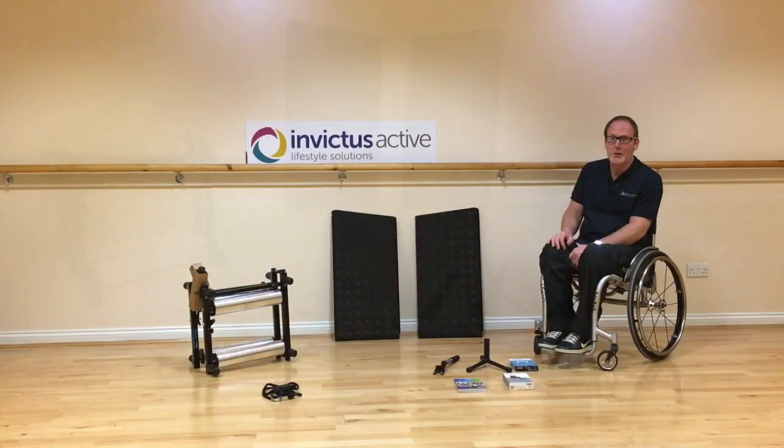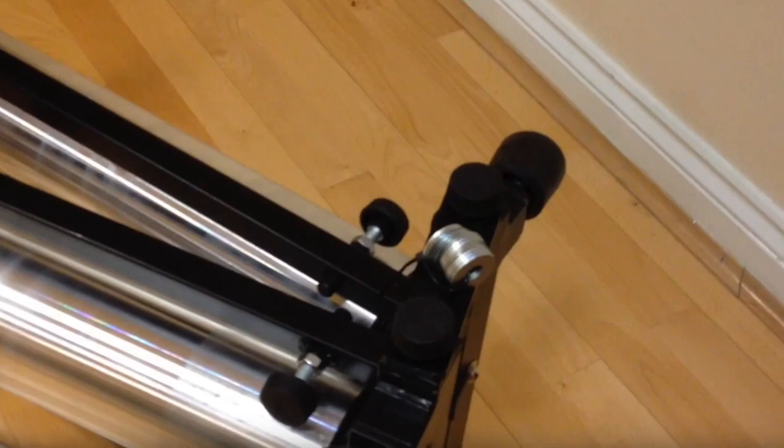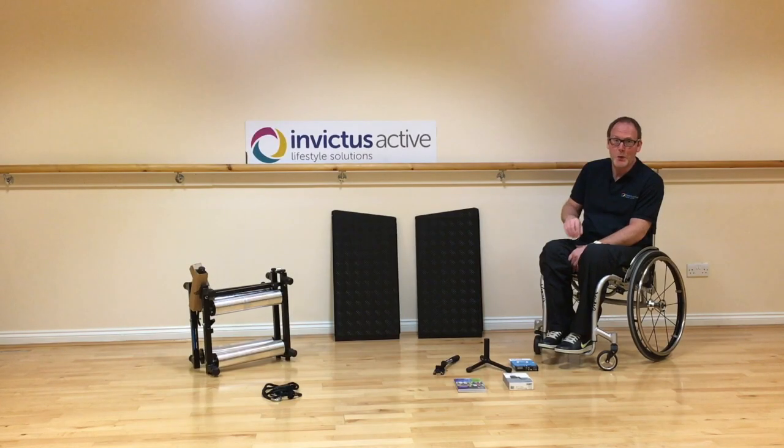When you open the box, you'll find attached to the trainer a set of washers. You need to keep these washers and put them to one side for the moment. We have a separate video that explains how these washers are used to adjust your camber and also to adjust any problems with wheelchair travel. In addition to this video instruction, if you visit our website, you'll also find written instructions which you can follow.